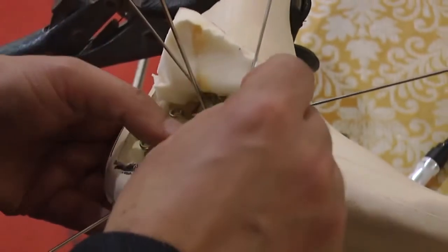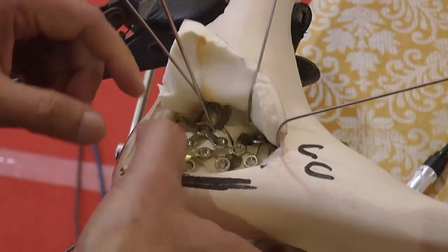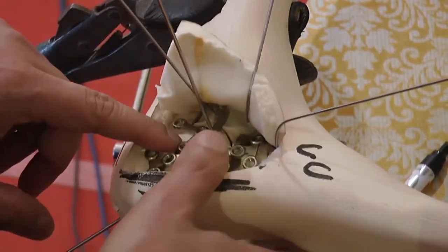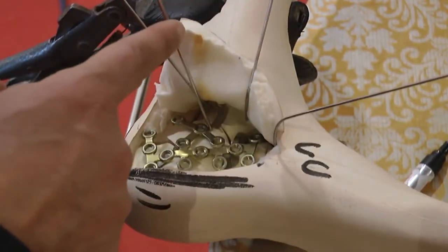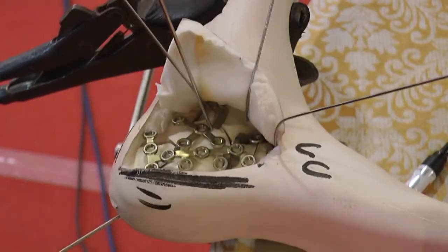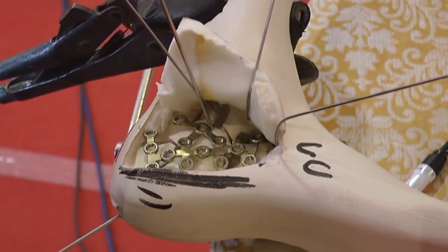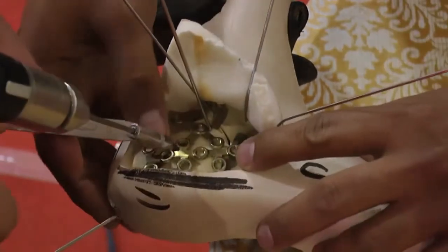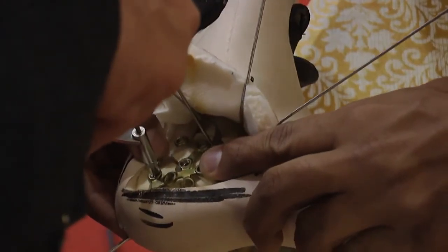Generally, when you put that plate, I first put a 3.5 cortical screw, so we have a 2.5 drill bit, into the tuberosity. The first screw that I put is into the tuberosity to stabilize the plate. Now, this wire is stabilizing the lateral facet, fixing it temporarily. You can choose to put one screw alongside the wire, just to hold the sustentacular fragment rigidly from this side. Can you stabilize the plate for me? Thank you. So first screw is into the tuberosity.